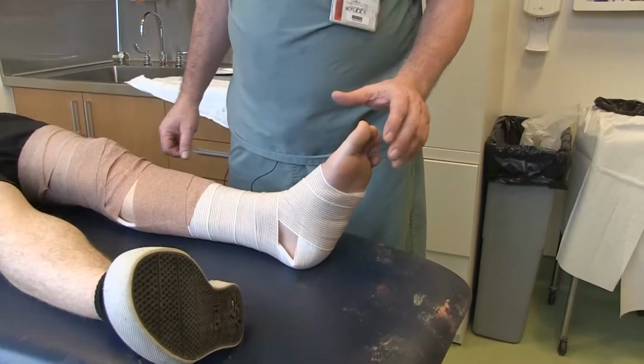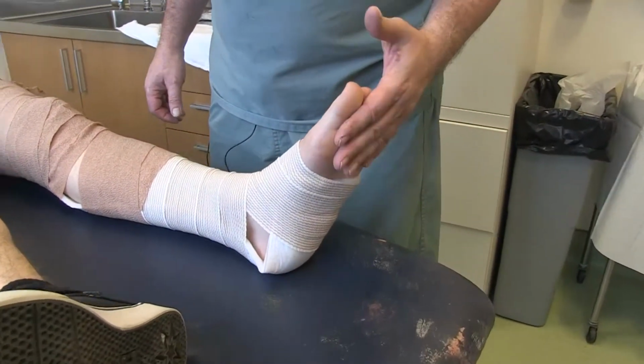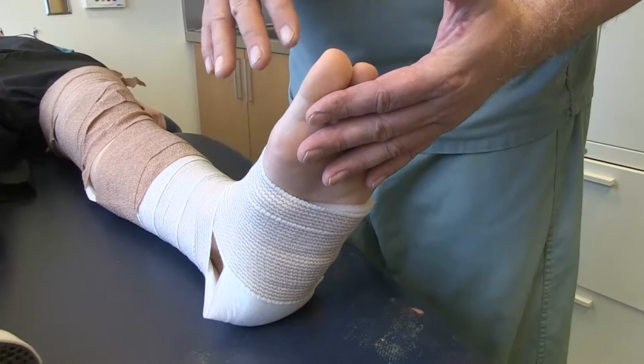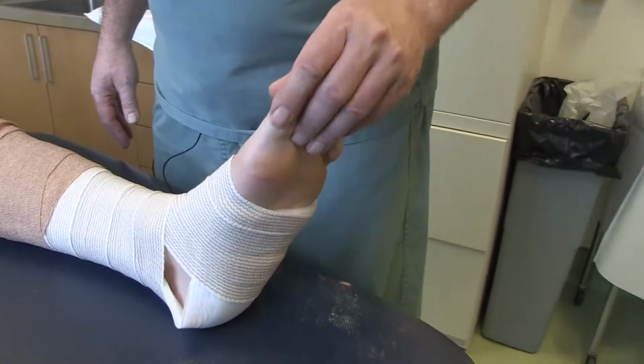Once the brace is installed, it is important to monitor the neurovascular symptoms. First, the toes must be colored, so neither blue nor white. The patient must feel them, so you can ask the patient whether they feel their toes or not.